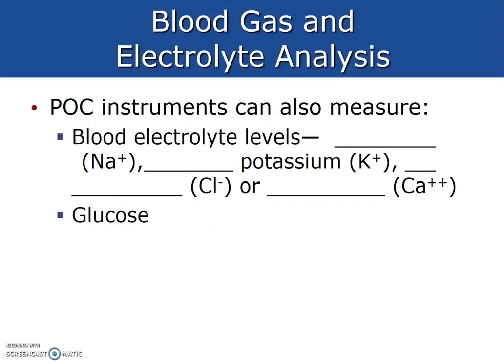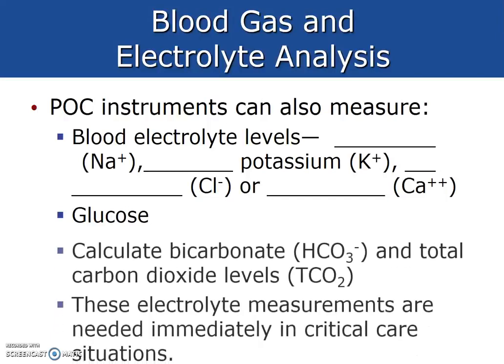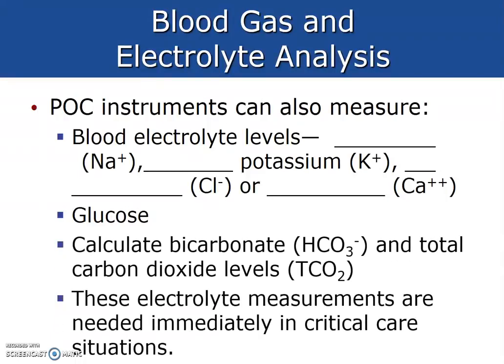Point of care instruments can also measure sodium, which is our first blank, potassium, chloride, or calcium. It also measures glucose, HCO3, TCO2. These electrolyte measurements are needed immediately in critical care situations.